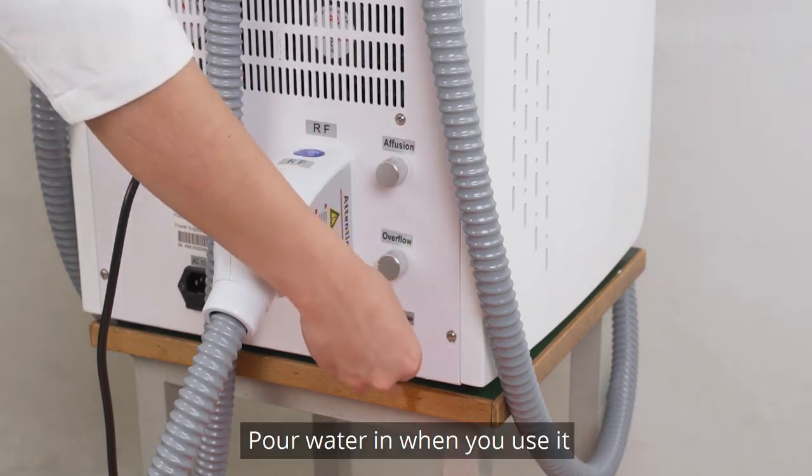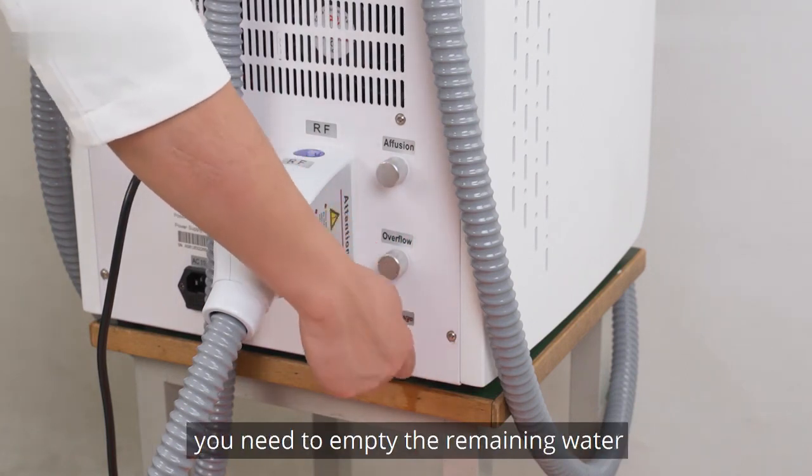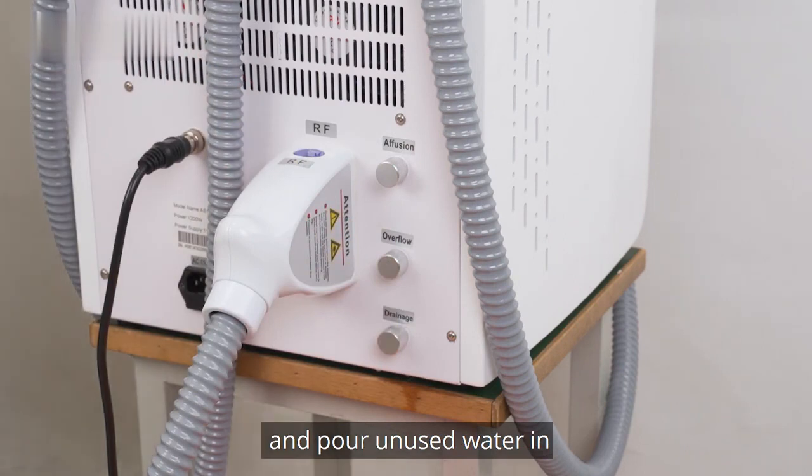Pour water in when you use it. If it has been 2 months since you last used it and there is still water in the machine, empty the remaining water and pour fresh water in.